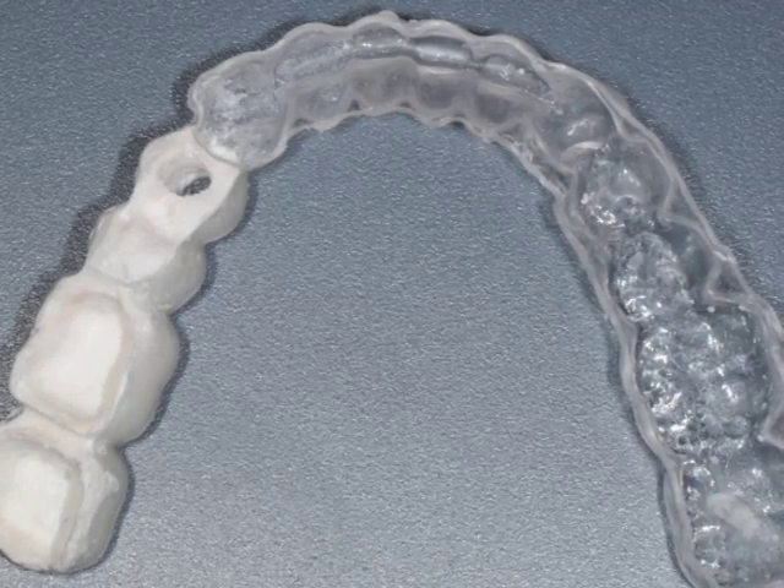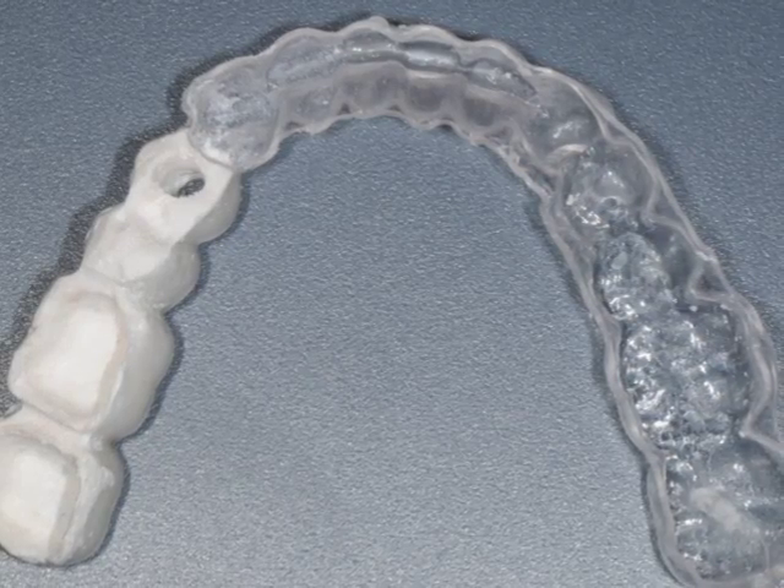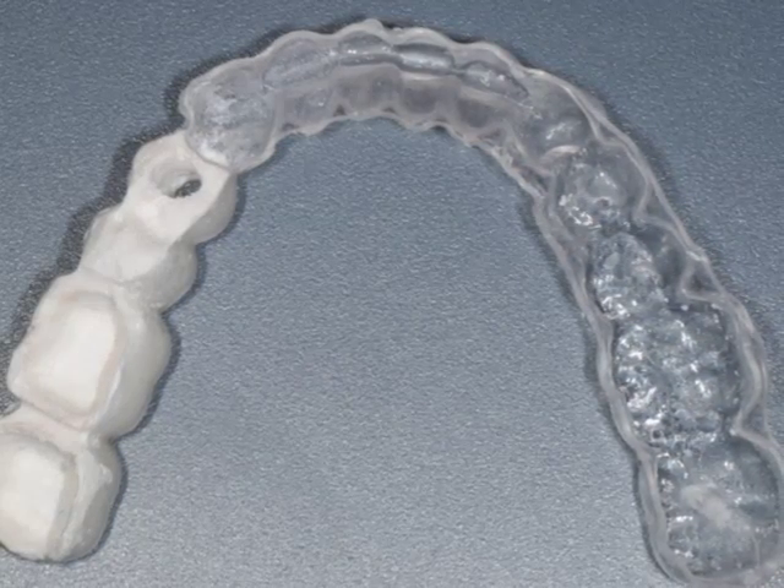Hi, this is Dr. Kazemi. In this short video, I'd like to show you how to fabricate imaging guides when planning for dental implants for your patients.